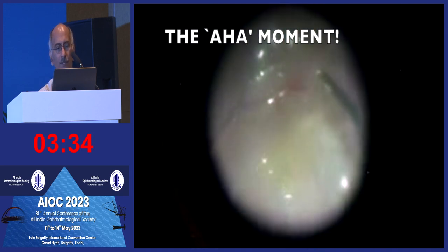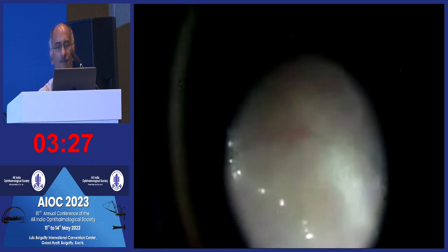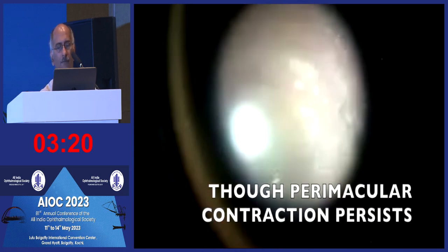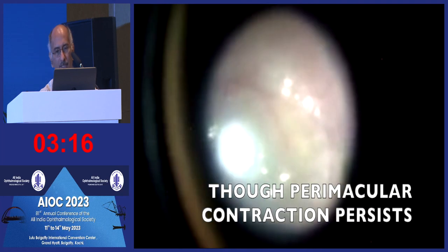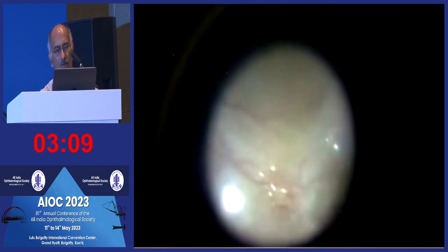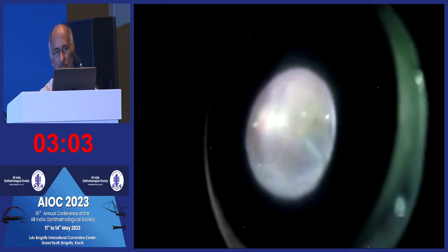And lo and behold, most of the folds cleared up. Pericentral, all these inner and middle retinal folds seem to have cleared up. Pericentral contraction did persist. I tried ILM peeling there also, but it was fraught with danger of bleeding, which would have made the situation worse.